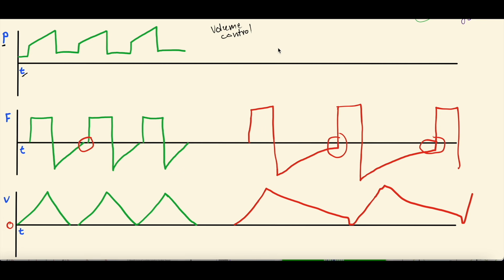And the pressure scalar is sometimes a little trickier. I think theoretically, pressure goes up when you're delivering a breath, comes back down, and as you AutoPEEP, some would suggest that you should start to see this kind of marching up of the pressure scalar, right? Where this is your AutoPEEP building up over time, although it doesn't seem to usually demonstrate that on the pressure scalar. It's a little more complex than that. But those are some hints for how you can diagnose it on scalars.